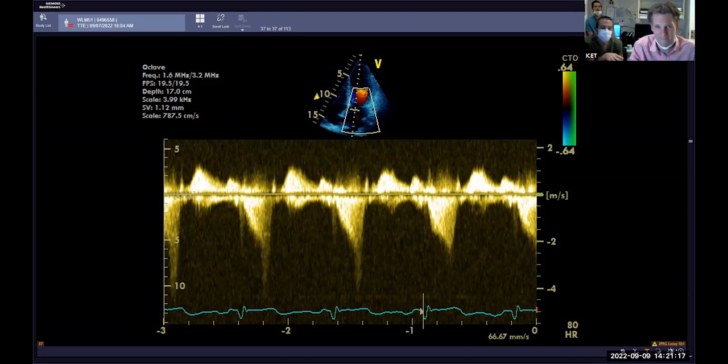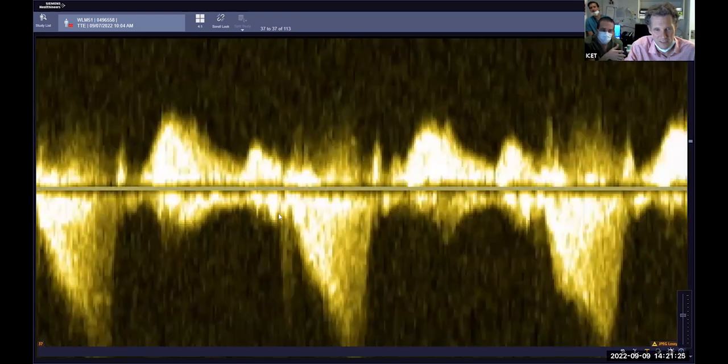Yeah. The way I remember that is because when the left ventricle starts to contract, it's got less resistance to go out to the left atrium than it does versus the aorta, because they always got high pressure. So yeah, I reckon that's MR starting there, and that's the LVOT obstruction starting there. It's the LVOT obstruction ending there, and I think it's probably a bit of MR in there.